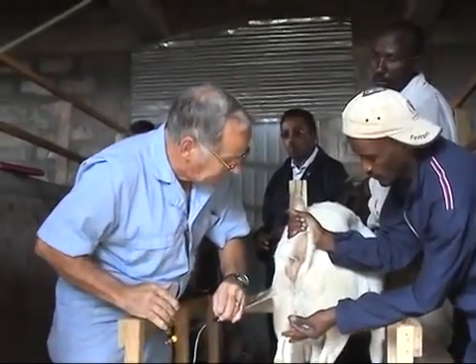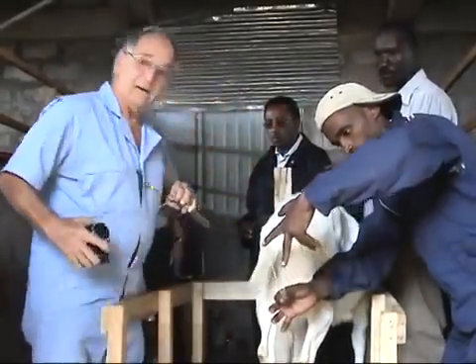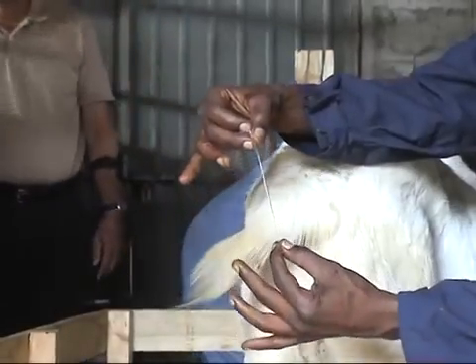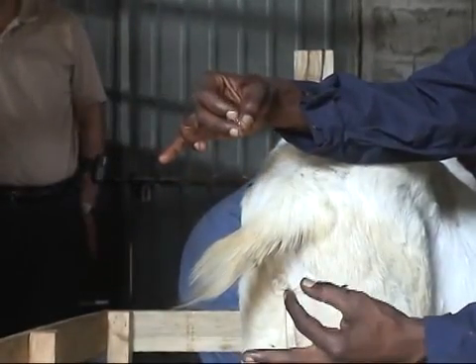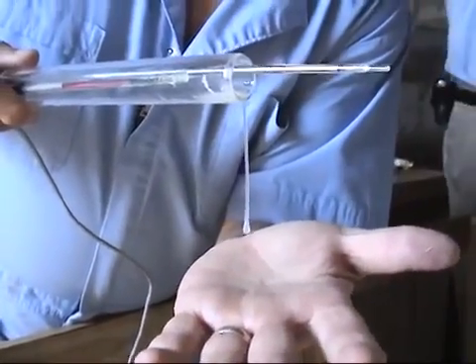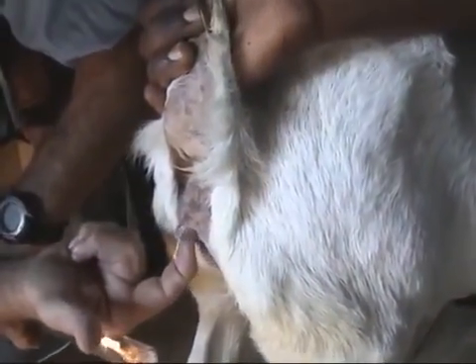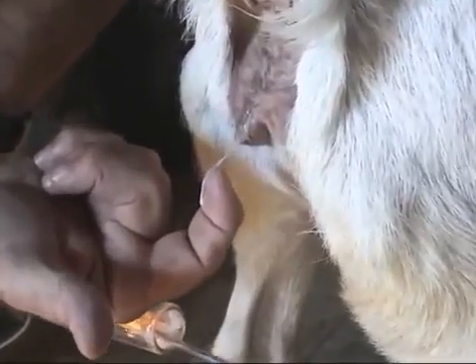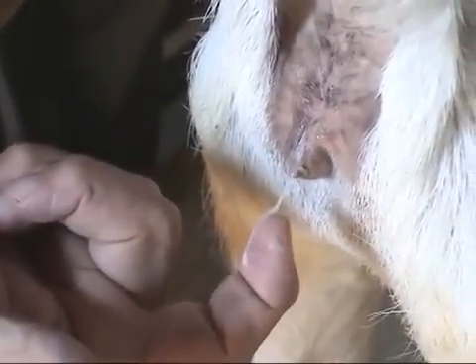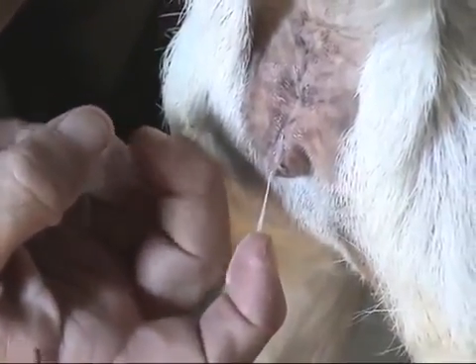And there is the mucus we were talking about — it's ideal. That's it. It's ideal consistency because it's cloudy but real stringy — like this is ideal. This type of mucus is typical of later and standing heat. It's whiter than the last one we looked at which was grey but still very viscous. And it goes from this consistency to almost a cheese-like character — not runny at all but very packed, compact, and dry type of discharge.